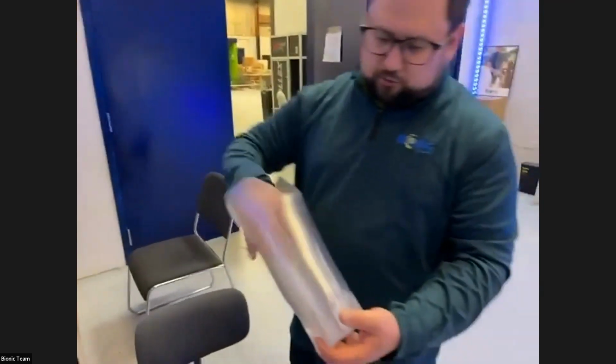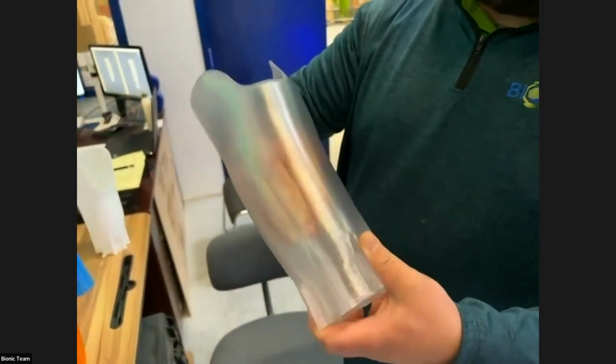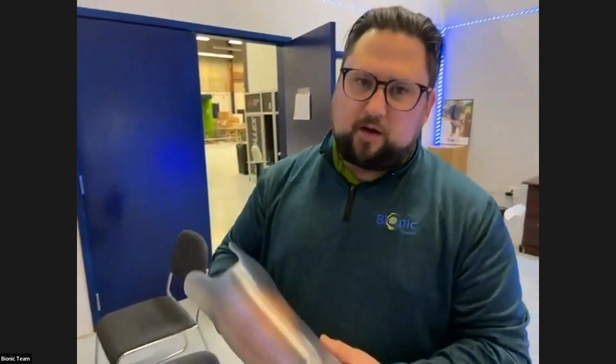Now, for seeing through the PETG socket, they are transparent, not as transparent as a traditional PETG socket, but good enough for our clinicians to get the results they want. Are there any questions on the printing lab right now, or are we holding questions till the end?